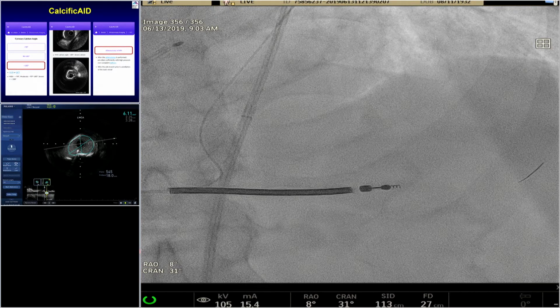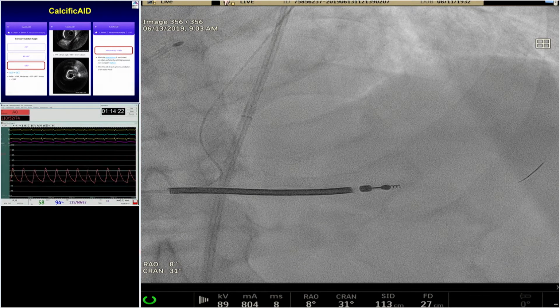Kinney, with this slow flow to begin with? Did you give some nipride? What's the blood pressure? All of those things. I think the hemo is being shown in the top center screen there. You see the blood pressure just about 110. And we have our nurses ready with the neosynephrine if at all we need it.